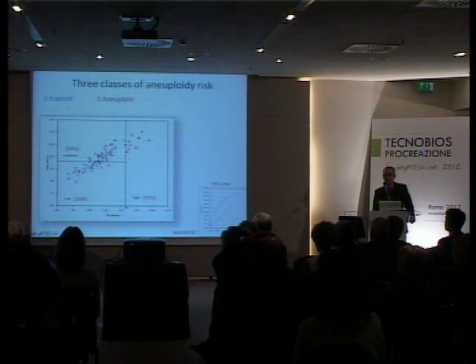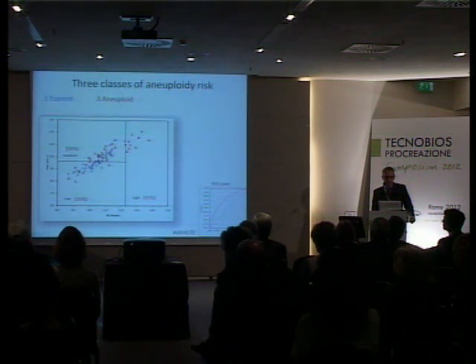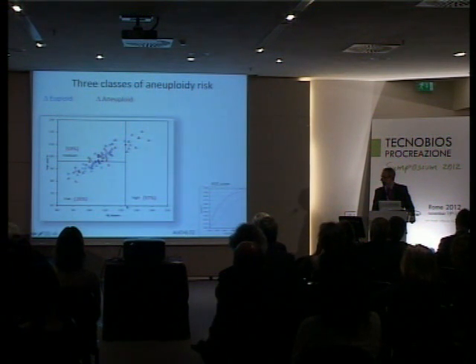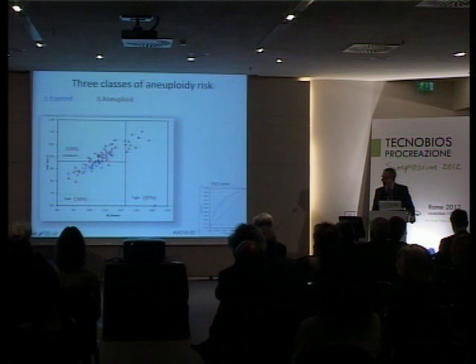At least it is suggestive of results that we have in the laboratory. In other words, when you have blastocyst formation beyond 133-134 hours, you have a very high risk of aneuploidies in these embryos biopsied through comprehensive chromosome analysis.